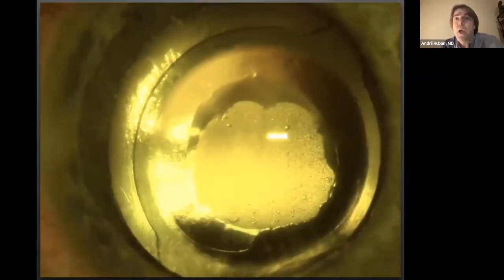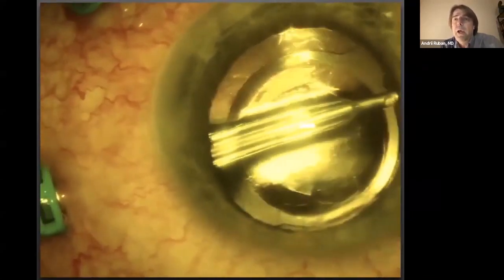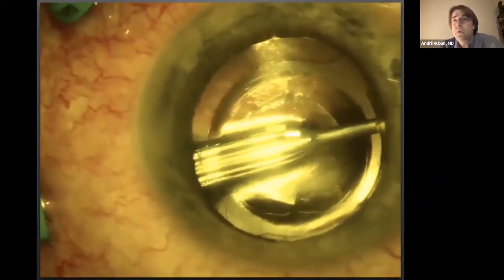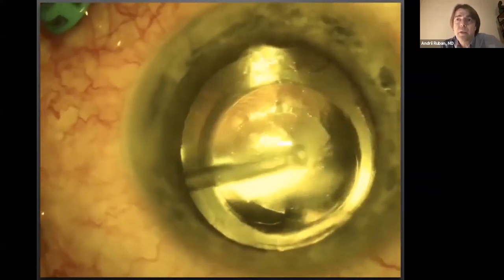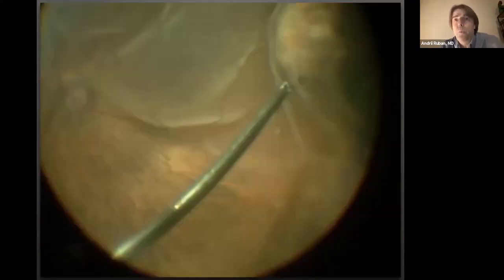If IOL (intraocular lens) fogging occurred during fluid-air exchange in pseudophakic patients treated with posterior capsulotomy, I wipe the posterior surface of the IOL with a cannula or cutter. I don't use viscoelastic because an optically thick and irregular coating layer deteriorates the visibility. Sometimes I use the bubble wiping technique proposed by Kintaro Yudo.